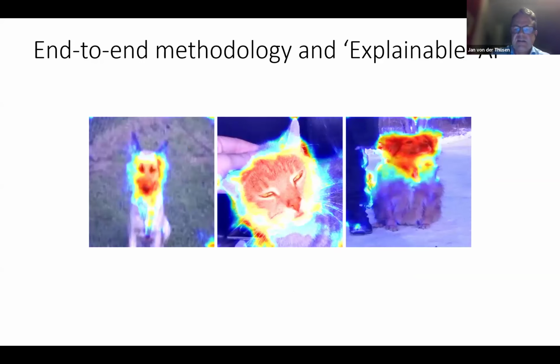So there's a degree of interpretability, as we know from some of these models, which in this case can tell whether something is a dog or a cat by just looking at the face of the animal. Something like that could be incredibly important for our community, because we're working with a slightly antiquated system from the 1990s in terms of classification of the different lesions that we can see in these biopsies. Perhaps we just need a new way of thinking about lung transplant rejection pathology.